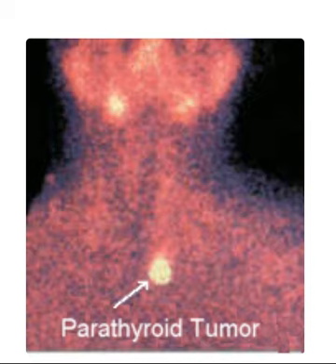Ultrasound. Often the first study that a doctor performs to identify an abnormal parathyroid, an ultrasound does not require the use of radiation. Conversely, an ultrasound involves the use of sound waves to analyze structures beneath the skin, such as the thyroid, parathyroid, and blood vessels.